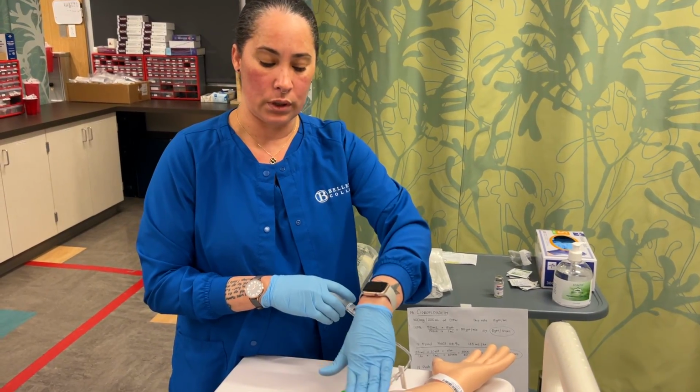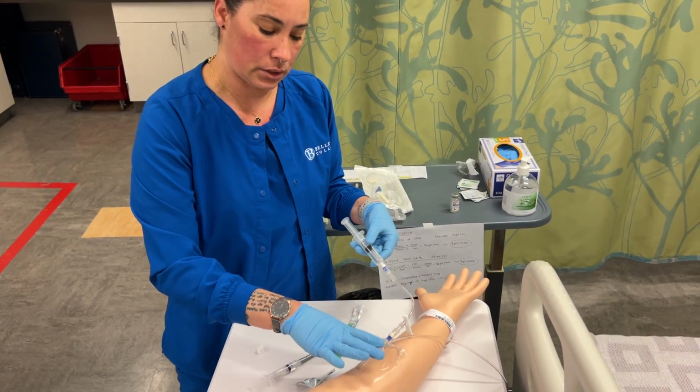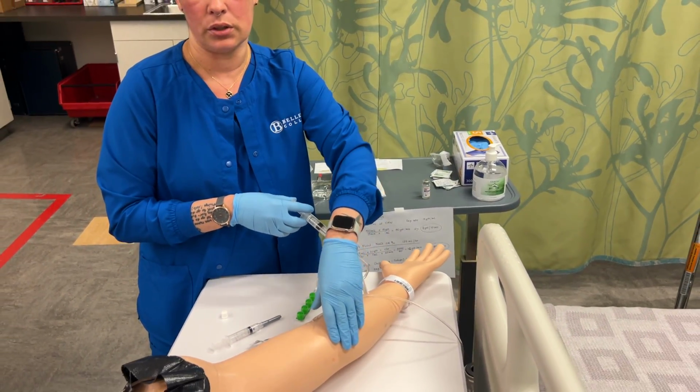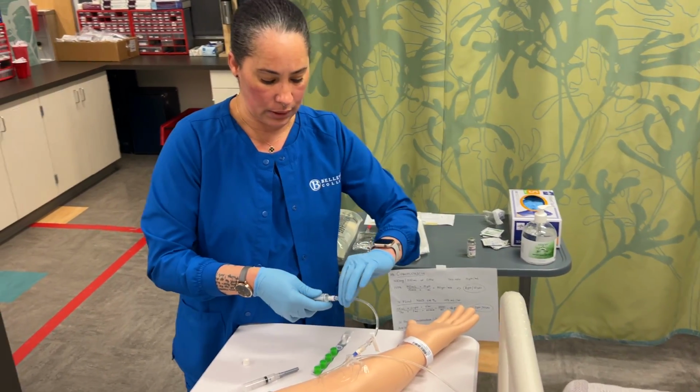While you're doing this, you're going to want to assess the site as well. Make sure that there's no leakage and it's dry and intact, and that there's no swelling or edema or redness that's going on while you're pushing it in. Ask the patient if they feel any pain or anything like that. All right, so we're done with that.